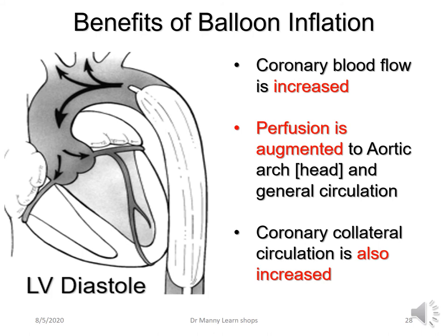What then are the benefits of balloon inflation? Coronary blood flow is increased because of an increased coronary perfusion pressure. Perfusion is also augmented up into the aortic arch, which is the vessels, the subclavian arteries, the carotid arteries in the head and the general circulation. And it will improve coronary collateral blood flow as well.